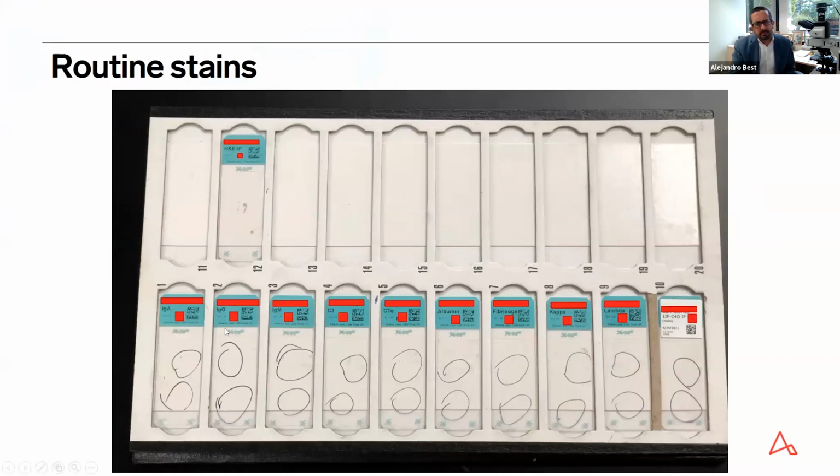So this is pretty standard across laboratories. Most places will do routinely on every single case 3 heavy chains, IgA, IgG, IgM. We'll do light chains, kappa and lambda. We'll do 2 complement stains, C3 and C1q. And very frequently, most labs will do albumin and fibrinogen. If it's a transplant, obviously you have to include C4d to the list.